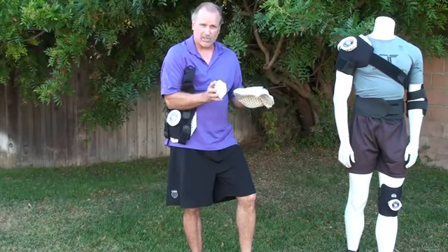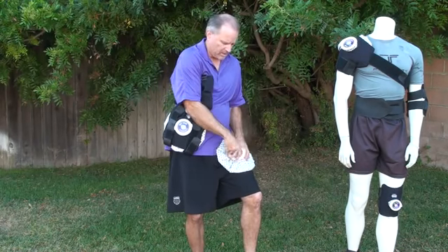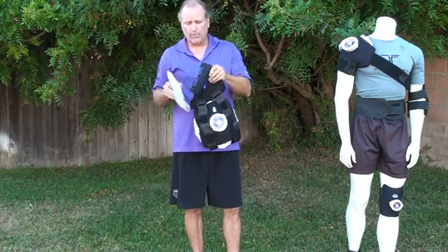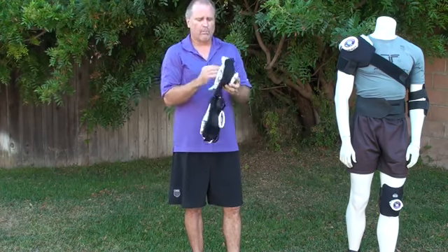So what we do is we want to burp the air out so we have nothing but ice. If we're standing somewhere we can put it against our leg or a counter, just place it down, seal it with the cap, and now we've got nothing but ice in that bottom layer of that bag. You do that with the double knee with each one of the bags and then put them back in the wrap.